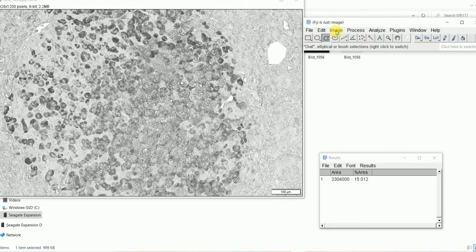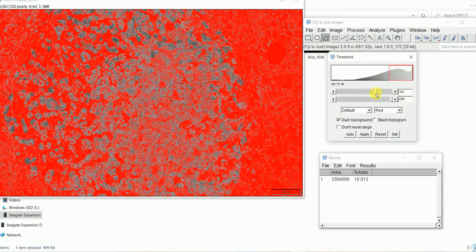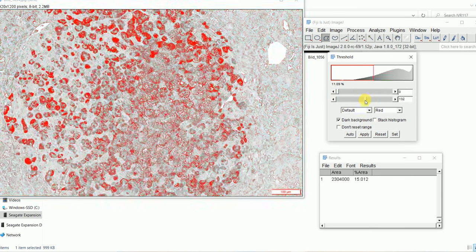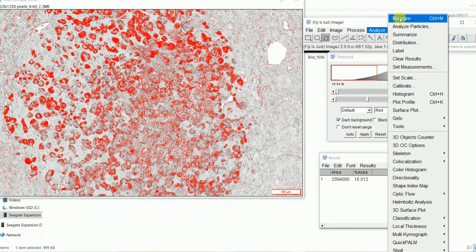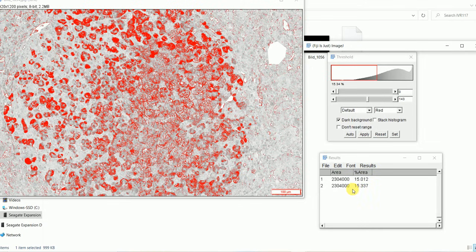If I go to image, then adjust, then threshold, and I will just drag it, something like this. Right now we don't have anything here because we got rid of that. Just try to get all your positive area red, and the area which is not positive in the original image, try not to get red as far as possible. After this you need to go to analyze and click on measure. So this is the area that we have, which is around 15%.